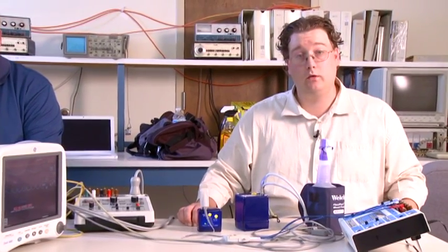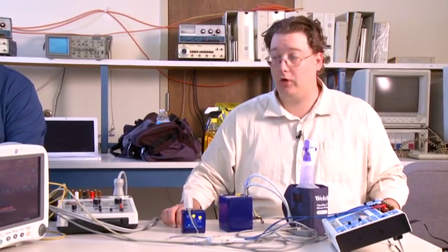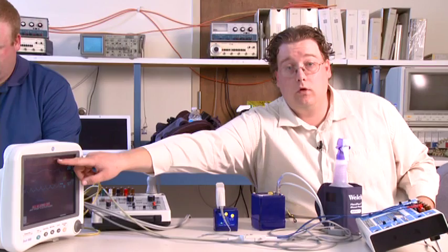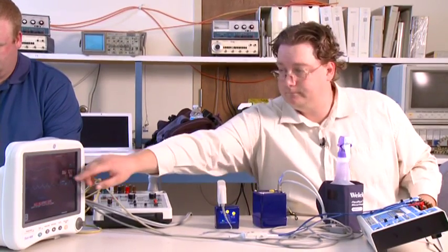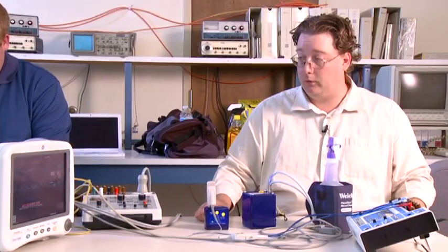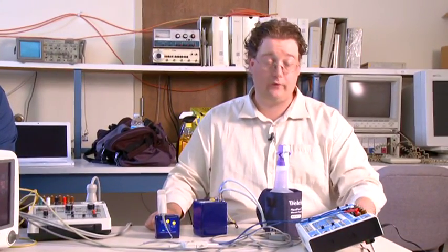240 beats per minute should also set off a tachycardia alarm on the unit, which indicates a high heart rate. So we're going to see the number flashing here, and the tachycardia alarm show up on the screen. Joby, if you could record 240 and check the alarm box as well, please. That concludes the ECG portion of the test. We'll be using the same tester again, however, to test the respiration rate.